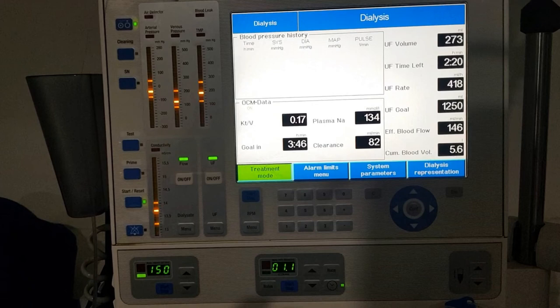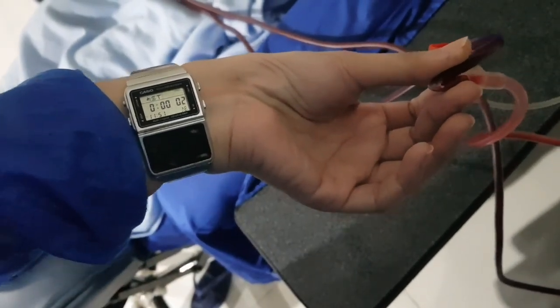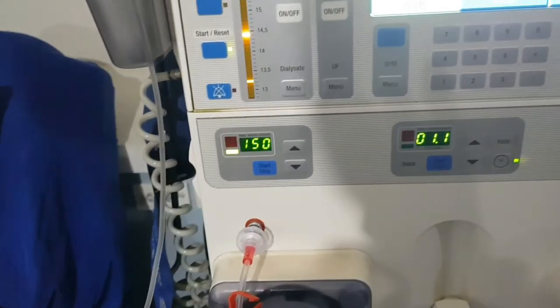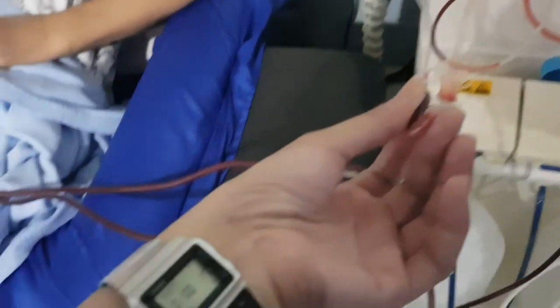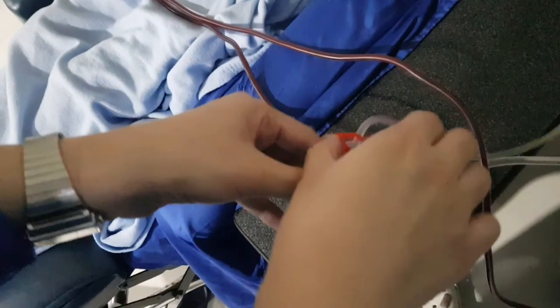Blood flow here is 150 ml per minute, so it will take 20 seconds to flush the exact volume of 50 ml bolus. Open the clamp and start the timer — this is why I love my Casio vintage watch, because it functions as both a calculator and stopwatch. I usually wait until the 21st second to fully complete the 20 seconds, then close the clamp.